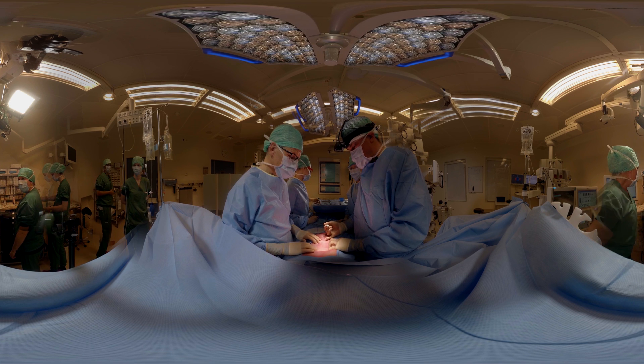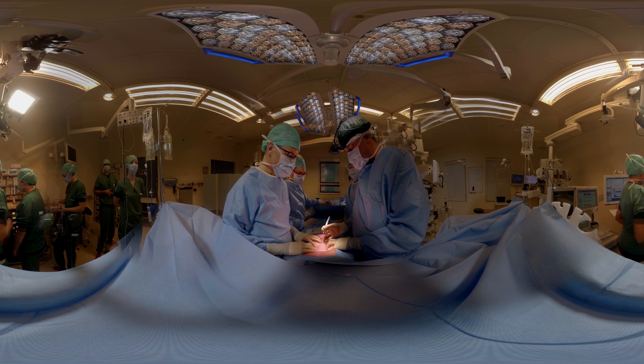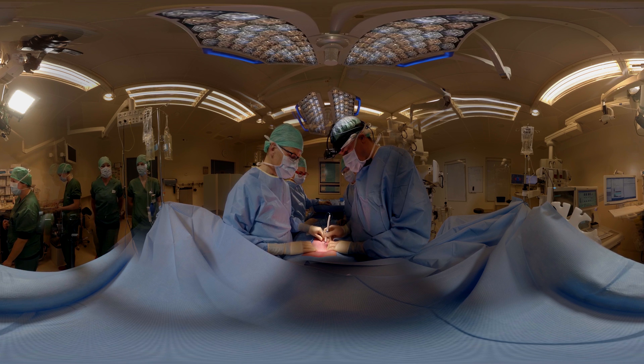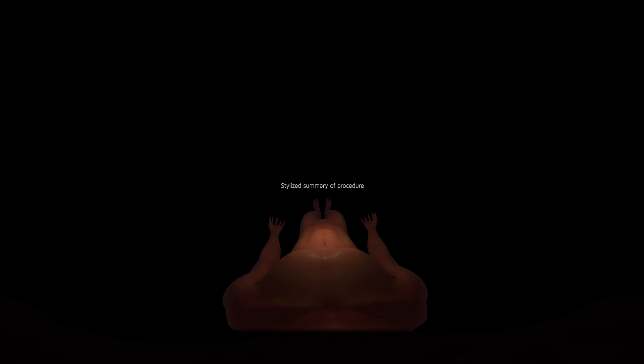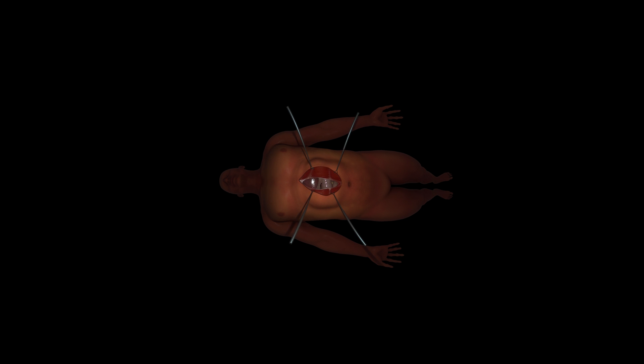We're going to start with the procedure for a patient with an incisional hernia, which will be reconstructed with a mesh. In this brief animation, we demonstrate how we treat the hernia. Once opening the skin, you can see the large defect in the muscle layer. We treat that by positioning a mesh below the muscle layer, and we use so-called tackers to keep the mesh in place.